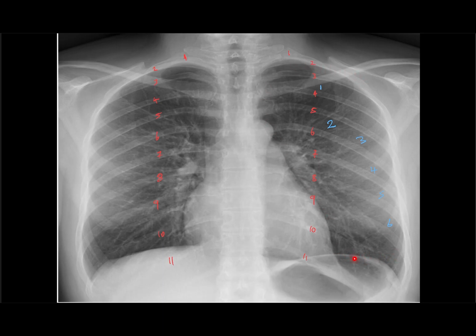So this is the gastric bubble. It is dark because it contains air. It corresponds to the fundus of the stomach. If you remember from anatomy, the fundus of the stomach normally contains air, and air is radiolucent. So that is why it appears dark. If you look at the midline, you are going to see a tubular structure, a tubular structure whose inner part is a bit dark. That tubular structure is the trachea. The inner part is dark because the trachea contains air.